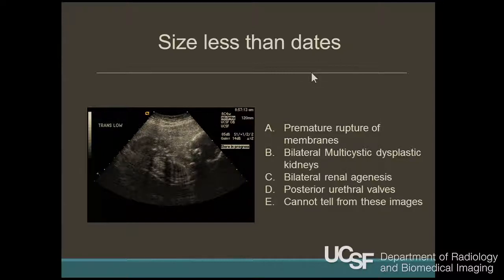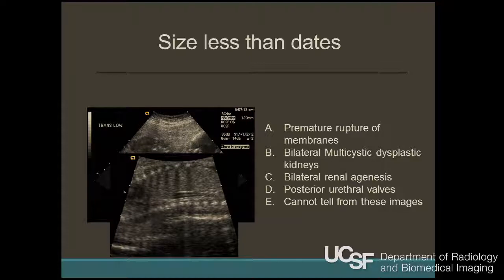So this is back to OB ultrasound again. History with size less than dates. So there's one observation to make here. And I'm going to show another picture. This is in this baby.